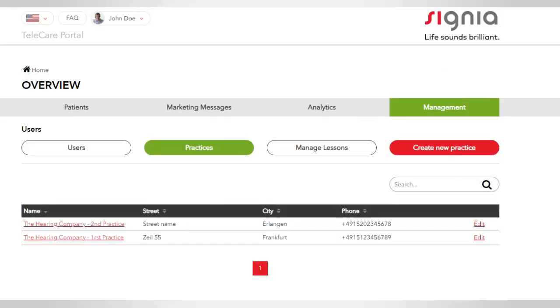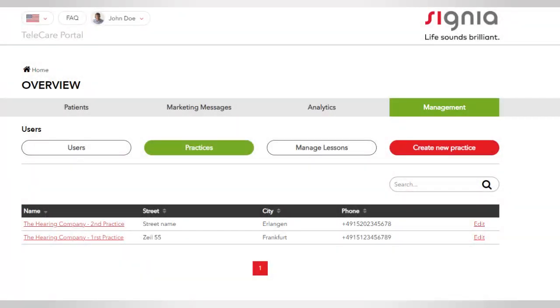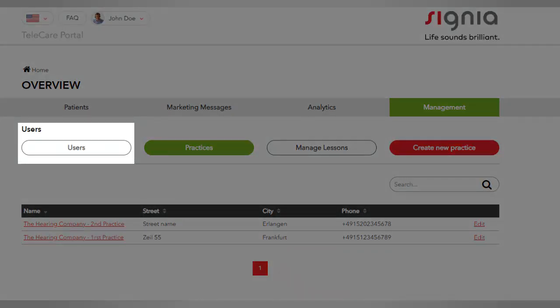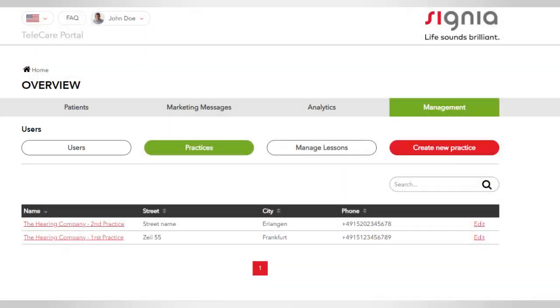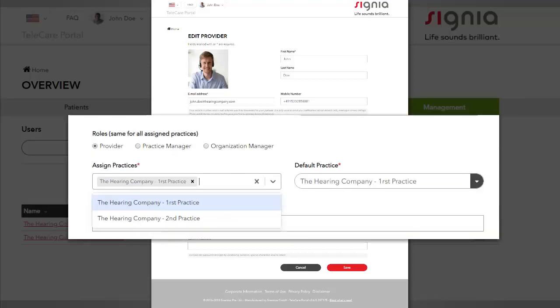By using the tab Management on the main menu, you can easily add additional practices and users. By selecting Users, you can assign hearing care professionals to a practice or multiple practices. You also have the possibility to define different roles for them. There are two roles that you can assign to a user.